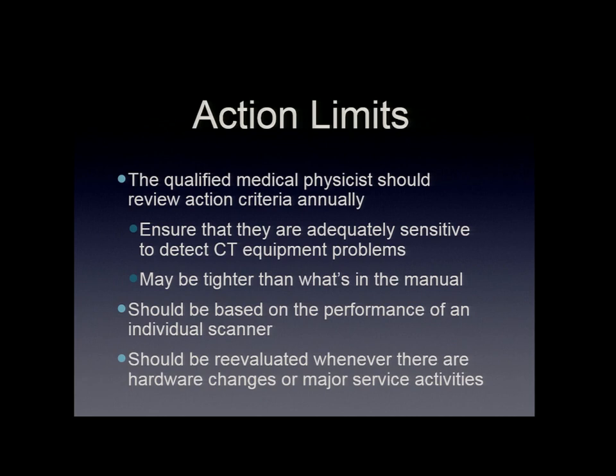Therefore, they want the qualified medical physicist to evaluate the QC program on an annual basis to make sure that the criteria have been met in this ongoing process. They also want the QMP to evaluate: is this QC program effective? Is it sensitive enough to detect any problems? You can have really broad control limits and be doing it every day, but it's not really picking up any issues. So you want to make sure you can evaluate it, that it's somewhat effective.